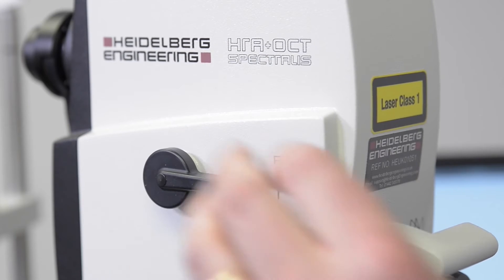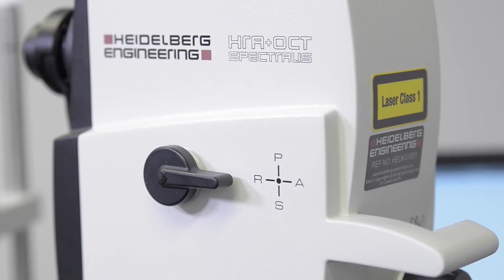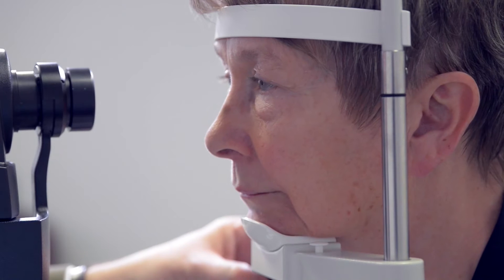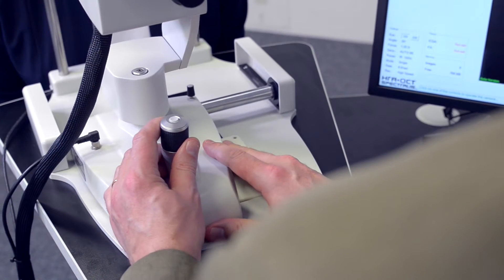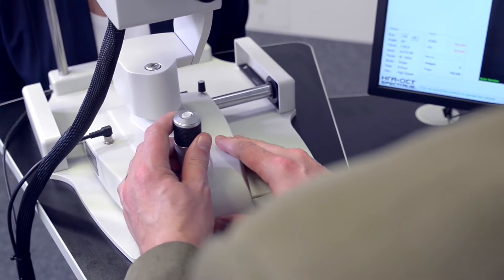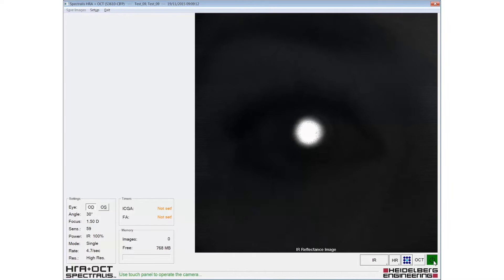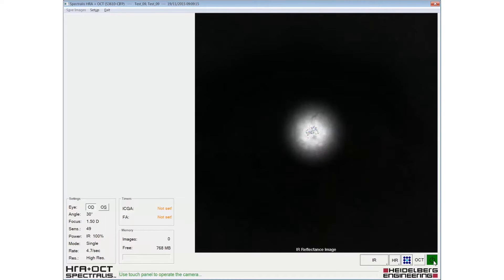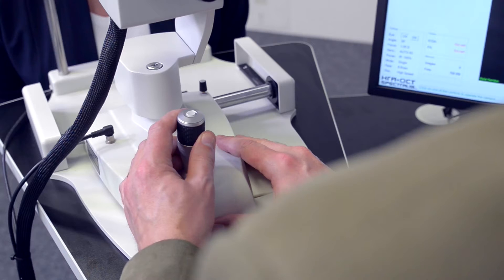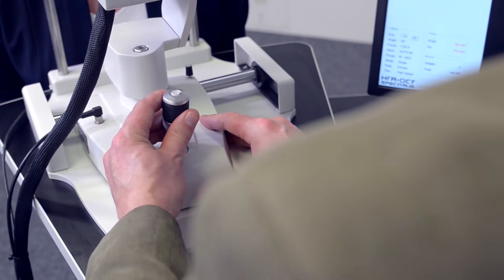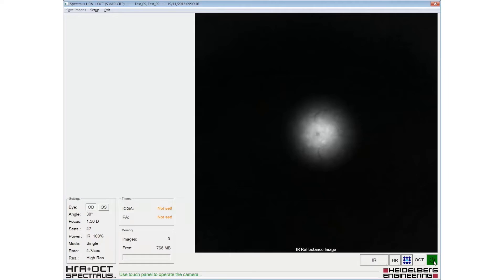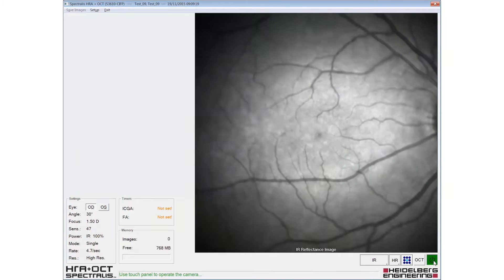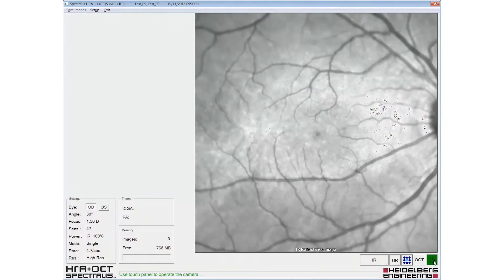The appropriate fundus imaging modality should be selected and the headrest should be adjusted so the outer canthus of the eye lines up with the mark on the headrest. The patient should be instructed to look at the internal fixation target. The fundus image is aligned by sliding the camera head forward, keeping the reflex from the patient's pupil central. The fundus image should be evenly illuminated from edge to edge.